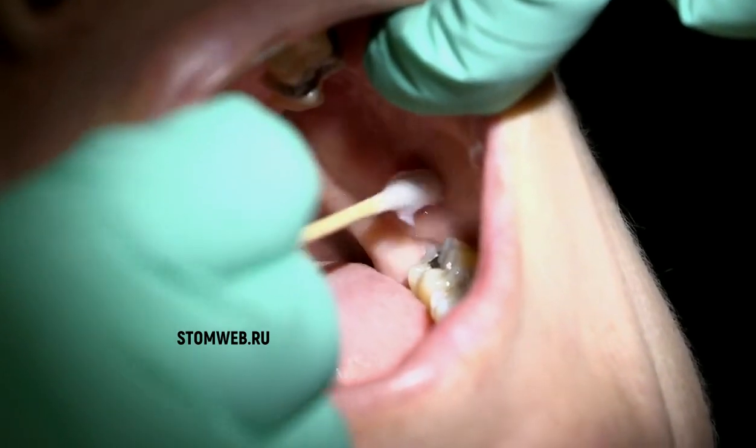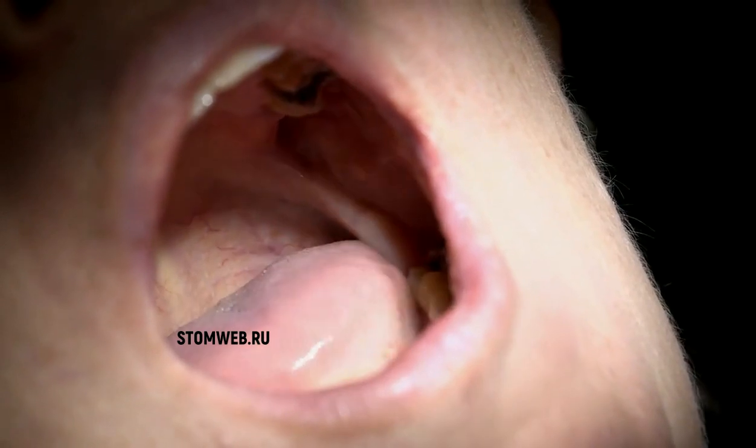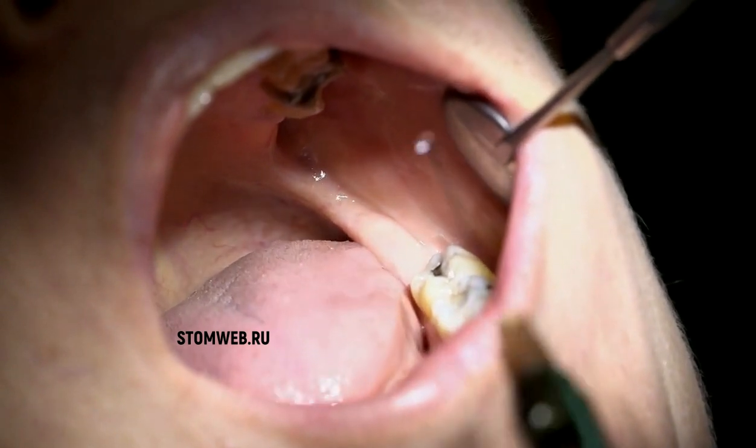The needle length for the long buccal block may be long or short, but usually this injection is used in conjunction with an inferior alveolar nerve block, in which case you would use the same long needle.